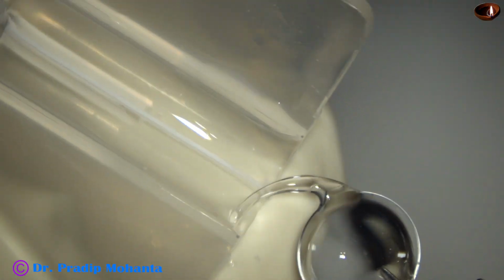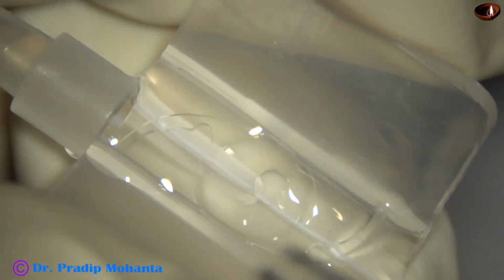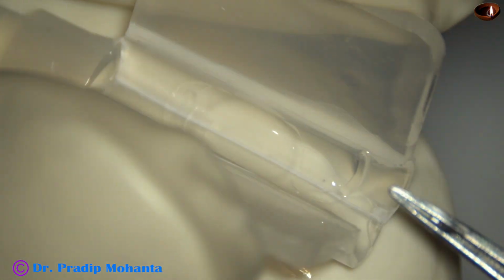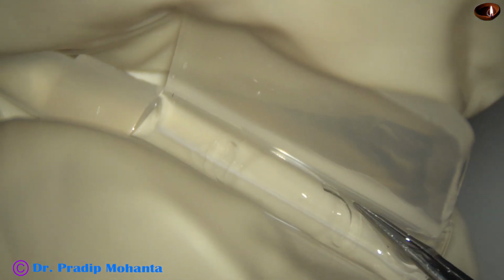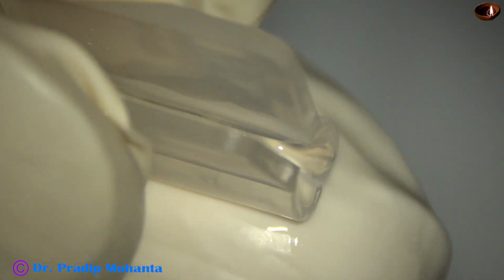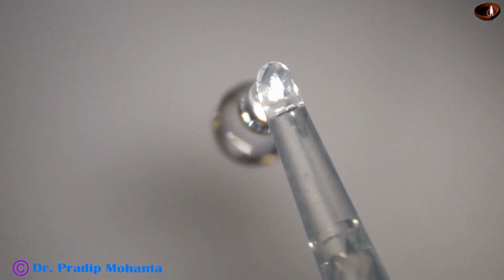And this is a Tecnis 1 intraocular lens, and I am trying to implant this lens by Appasamy's cartridge. See how beautifully the lens goes, and the haptics are placed in this way. Then we close the cartridge. The wings of the cartridge are closed. It's a butterfly cartridge, and how smoothly the lens is going forward.